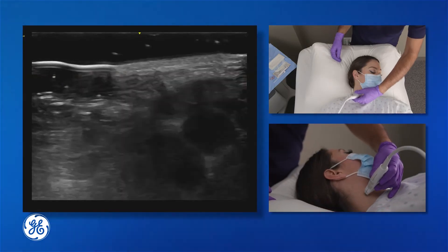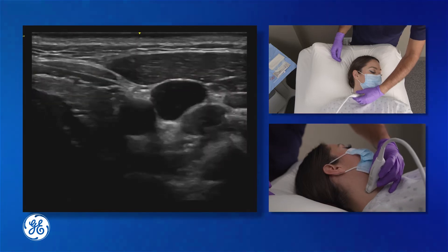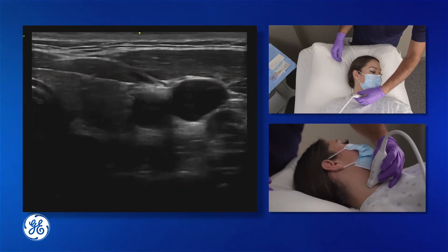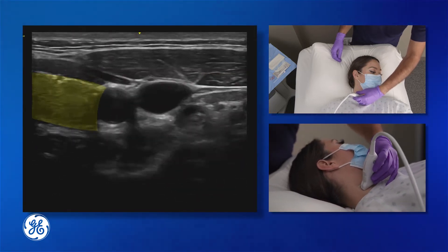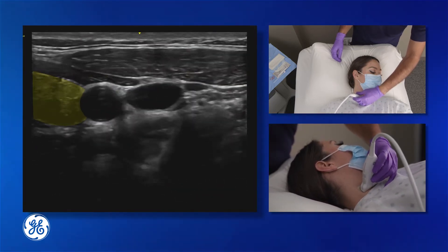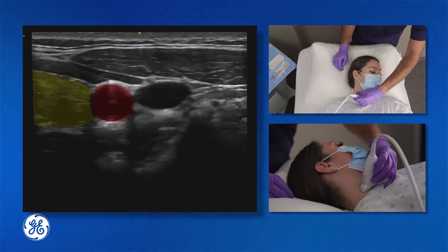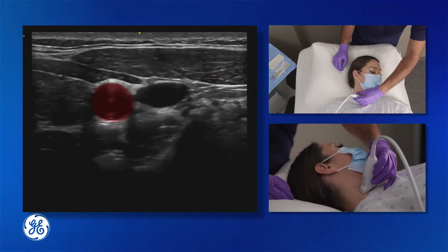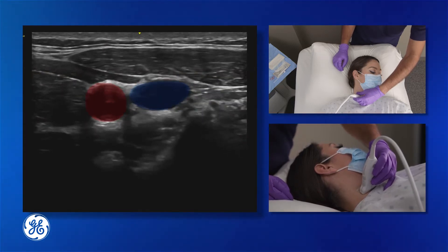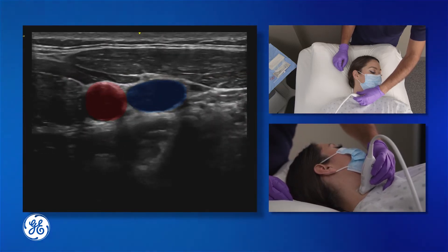We start out by scanning the patient's neck. Adjacent to the thyroid gland is the carotid artery and the internal jugular vein.